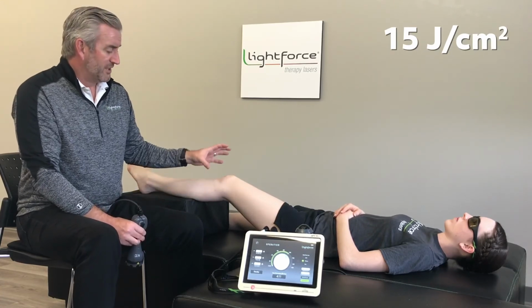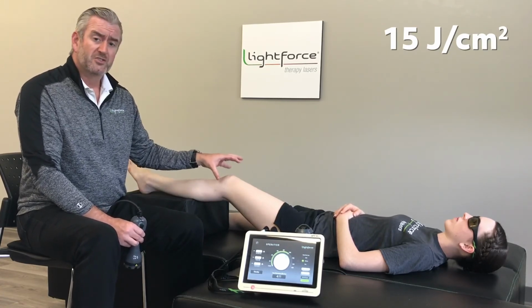So if you're in a scenario where you don't want to overdose the joint itself, but still get some analgesic effects, you can do that both in the sciatic tract as well as the femoral nerve more proximal to the knee, and that tends to work really well. It also isn't a bad idea to treat the nerve roots that are involved. So if you went to the low back from L2 to L5 and treated that ipsilateral side at 15 joules per centimeter squared at high power, the highest that your machine had, you're going to maximize the benefit there by treating the dorsal root ganglia where the cell body resides for those afferents.